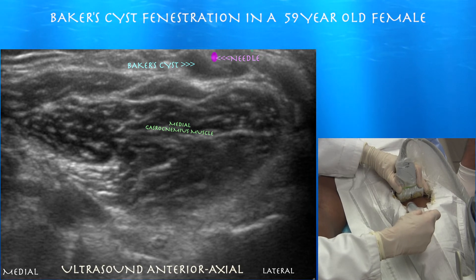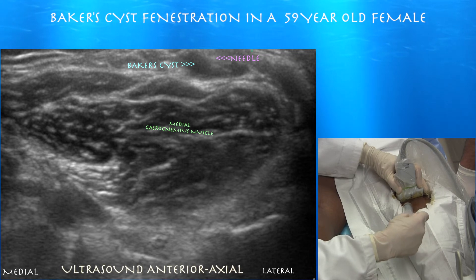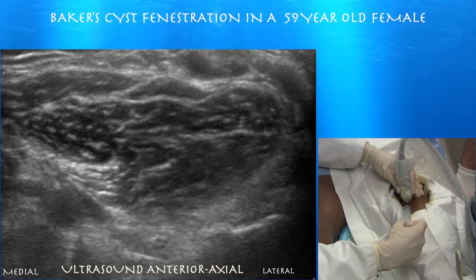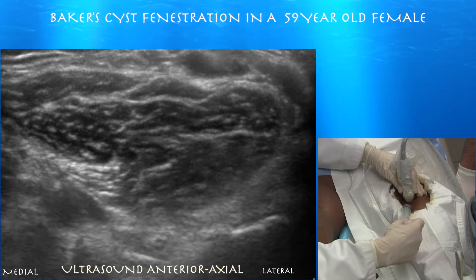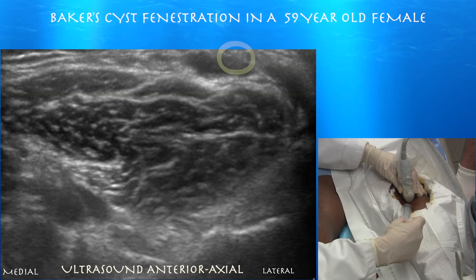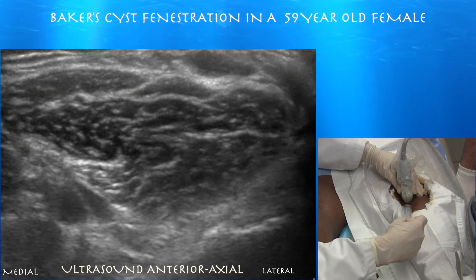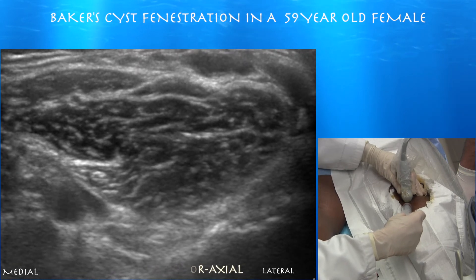I'm just breaking up the back of this wall. This axial view helps with medial-lateral orientation, but once you have that you're probably better off going to the long axis view. We've gotten most of that cyst already — I might have been better off leaving a little more fluid in there to inflate it more and get more of the wall.